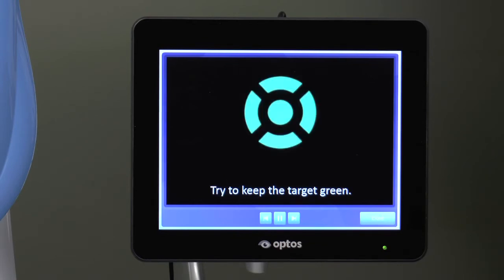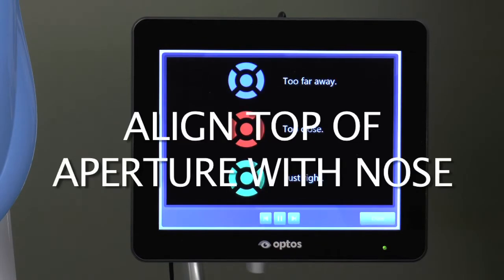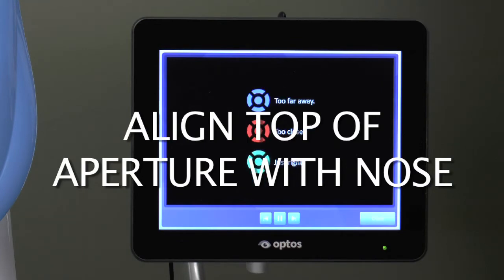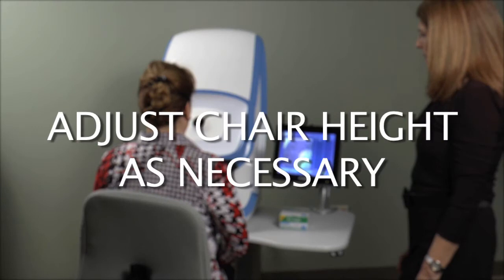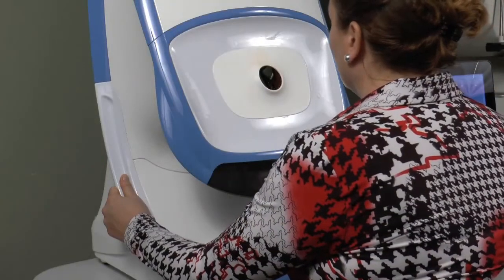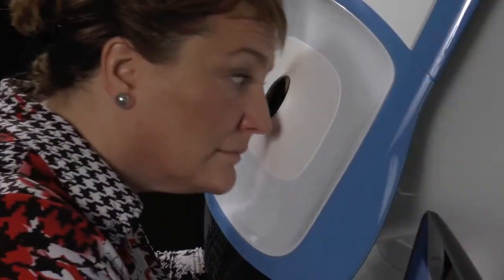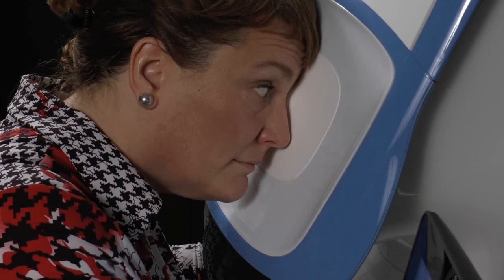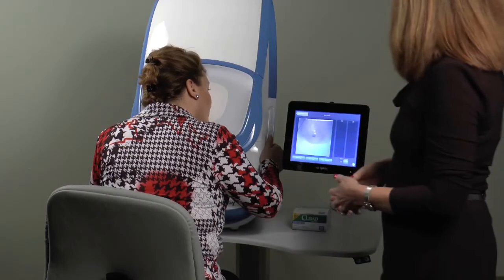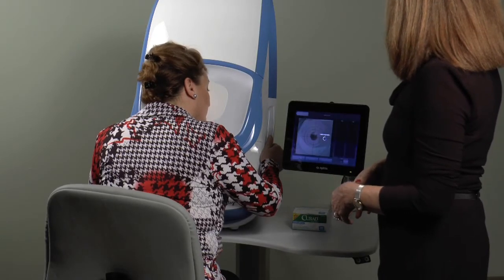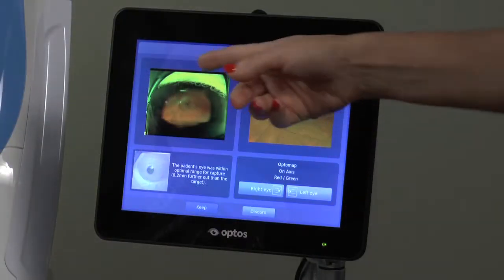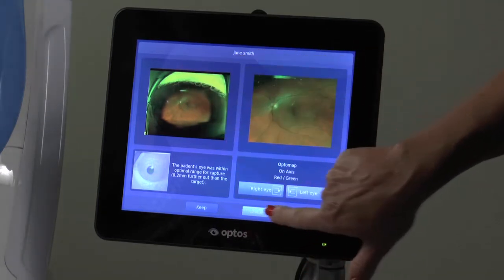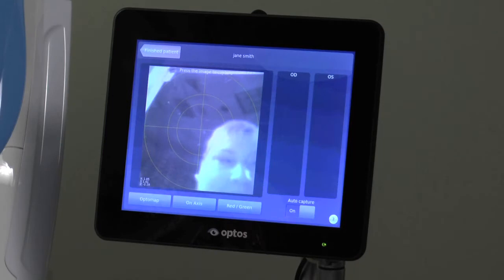If you are using an adjustable table, set the height to allow the patient to visualize the blue alignment target inside the eye opening from where they are sitting. If you are using an adjustable chair, set the chair height to allow the safe movement of the patient in toward the instrument. Have the patient hold the hand grips on each side and move forward, keeping the light in the center of their field of view with both eyes open, pressing their forehead in and rolling their cheek until the light goes green. Then an image will be taken if auto-capture is active. If the image is not satisfactory, you may choose discard, then delete, which will permanently delete the image. You may prefer to keep all images and wait until the end of the session to delete.